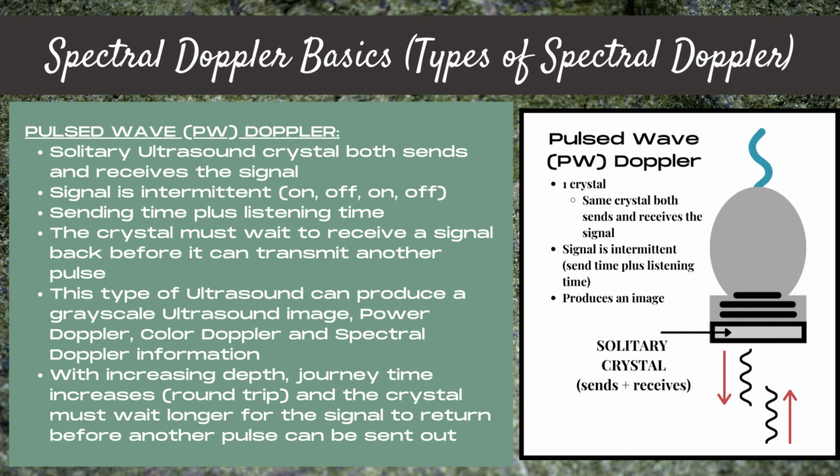With pulsed wave spectral Doppler, there is a solitary ultrasound crystal which both sends and receives a signal. And the signal is intermittent. On, off, on, off. So you have sending time, plus you have listening time. And the crystal is going to have to wait to receive a signal back before it can transmit another pulse.